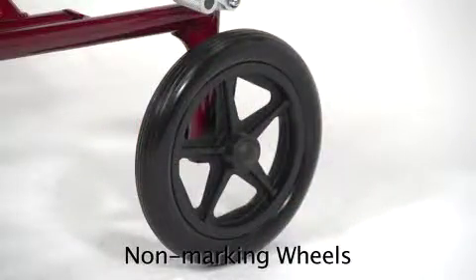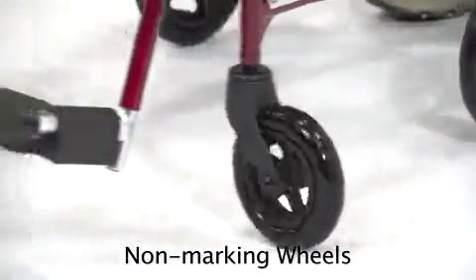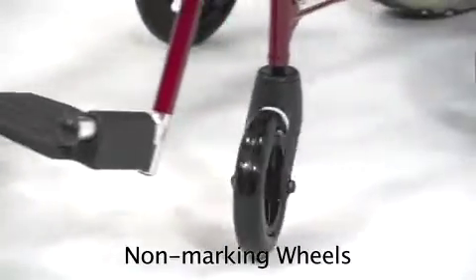These solid 8-inch rear wheels make for a smooth, stable ride, and the 6-inch front casters allow the chair to maneuver tight spaces.